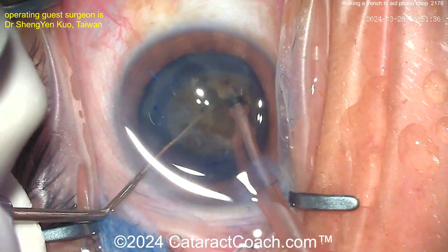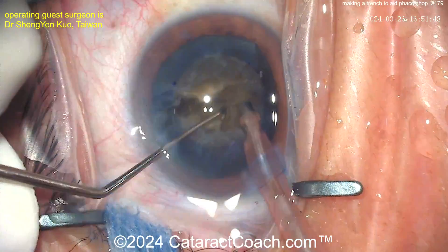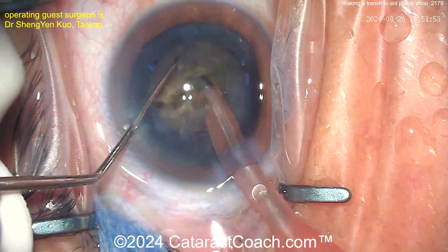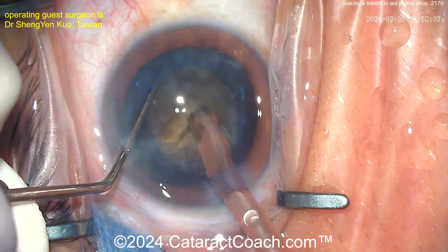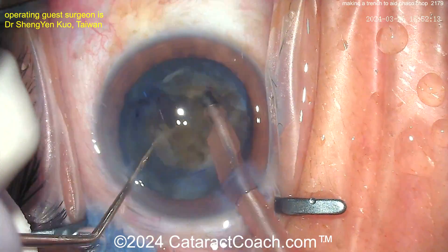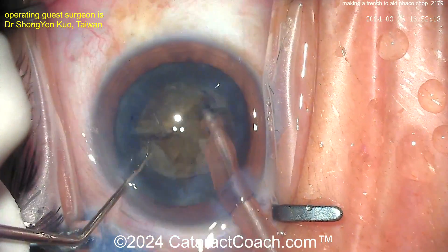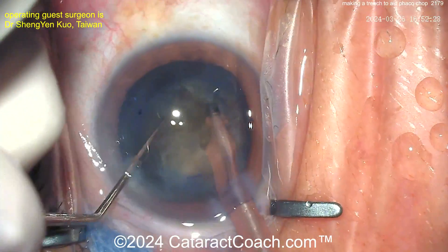There's the chop — look at the separation. You can see it's a fibrous, dense lens, so the chop didn't propagate all the way through. That's okay — rotate it 90 degrees and now use the other side of that trench again to bury the phaco tip deeply and create another chop, trying to separate it out.